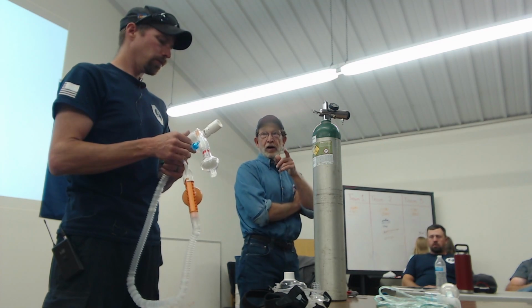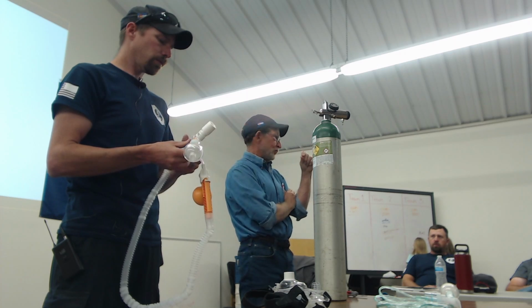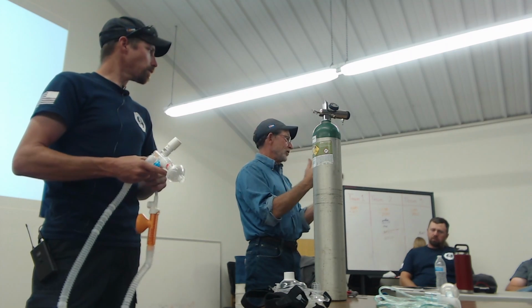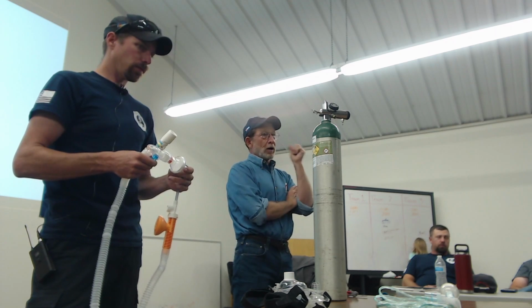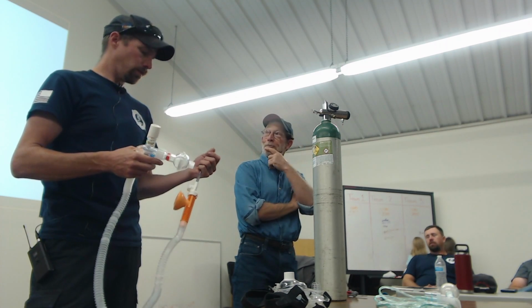So that PEEP valve at 5 means 5 centimeters of water of pressure. So not a lot of pressure, but we'll start at 5. That's how much pressure we're having to augment inspiration and to breathe against during expiration. And as Tyler said, we always start at the lowest and work up depending on the patient's response.